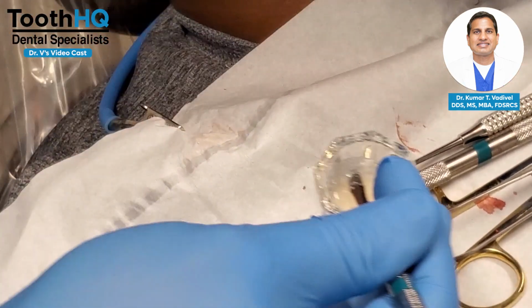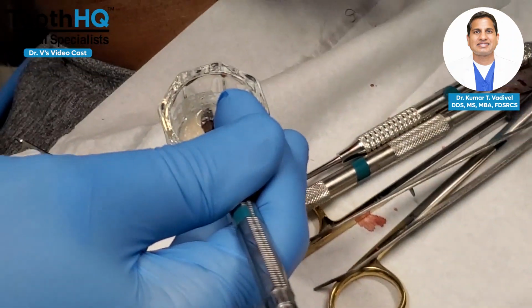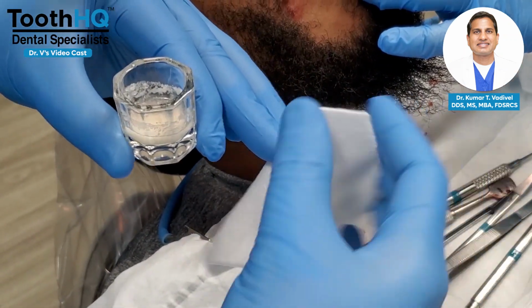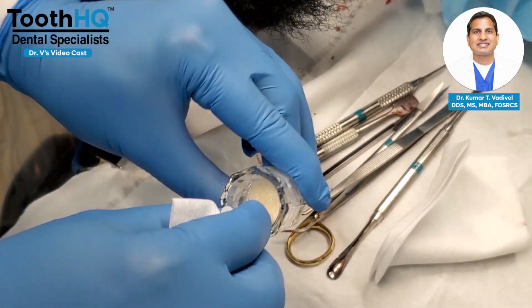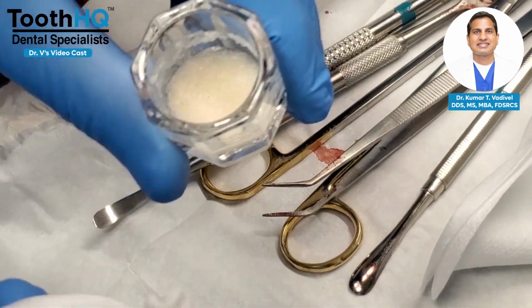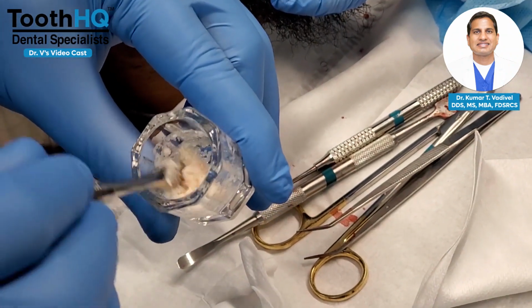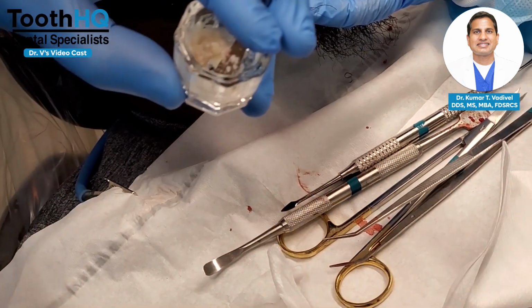After you mix it, you get a 4x4, which we have here, which is a gauze piece. After you mix it, you've just got to get the water out of the way. So with the 4x4, I call it wicking the water out. You don't want it too dry and you don't want it too watery, so you want to get a medium. As you do more of this, you will get to know the consistency that you really like, and you will find a way to get around this.